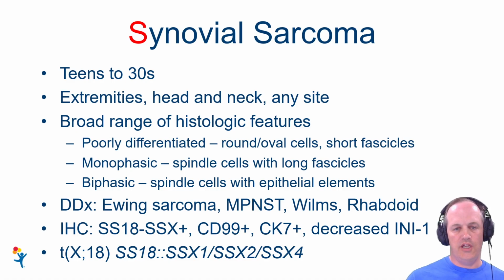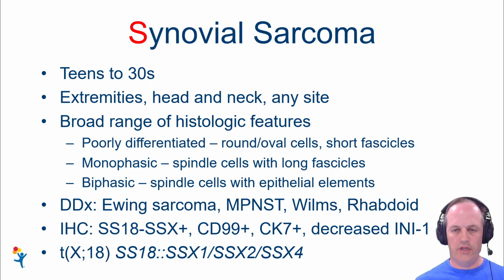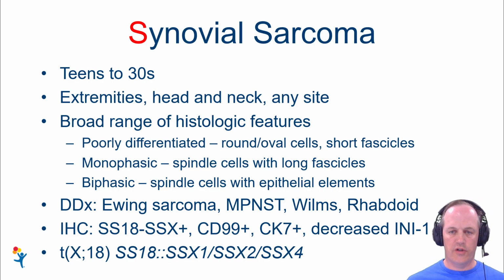I think the major update on synovial sarcoma from the last 5 years is that there is now a really, really good immunohistochemical stain. 5 years ago, people were talking about TLE1 and maybe they weren't so excited about it, but people should be really excited about immunohistochemical staining that directly targets the SS18-SSX fusion. Because so far it is incredibly sensitive and incredibly specific. It is actually an antibody that's designed to target the breakpoint in the SS18-SSX protein. So very good sensitivity, very good specificity.